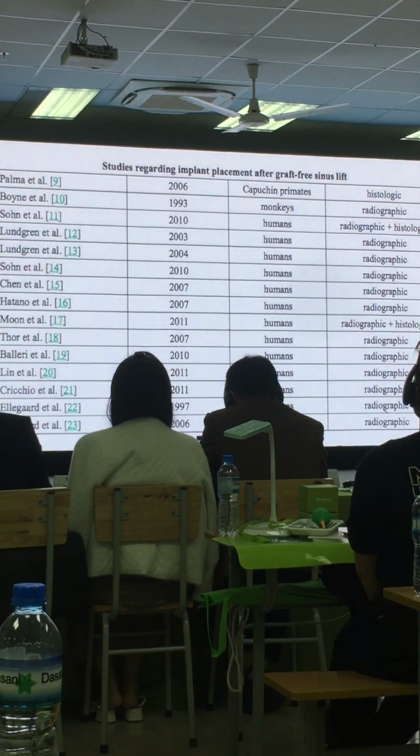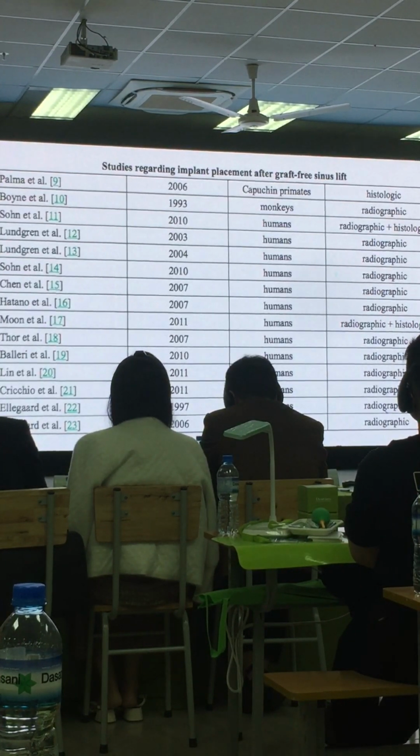Therefore, it was observed that as long as the intact sinus membrane was well elevated by the apex of the implant, like the tenting pole, without perforation, new bone was spontaneously formed in the space below the elevated sinus membrane in numerous studies.